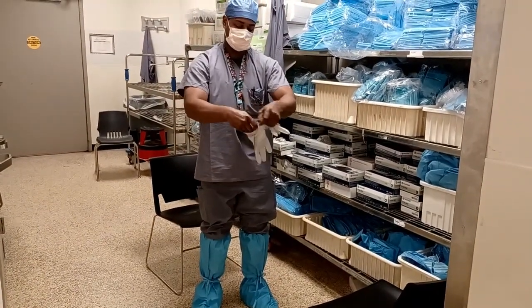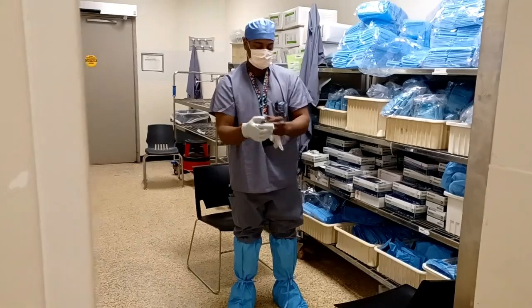Apply gloves. Make sure you have the appropriate size so that they stay on your hands securely.